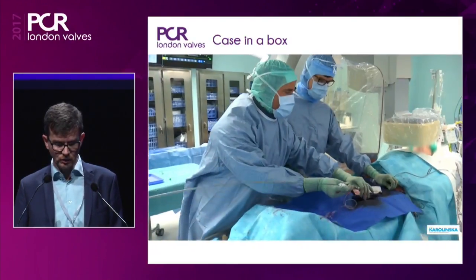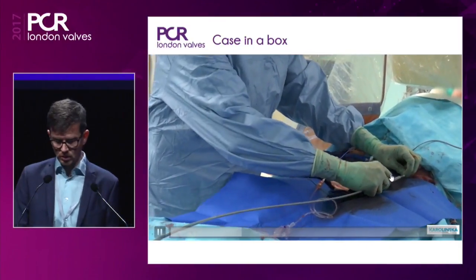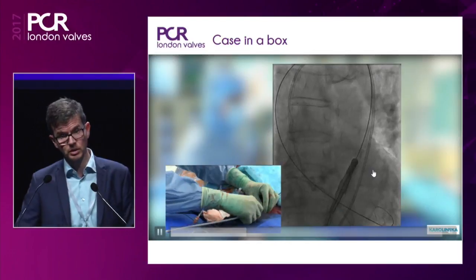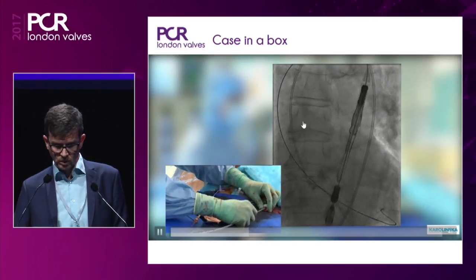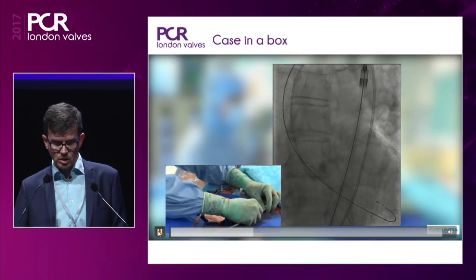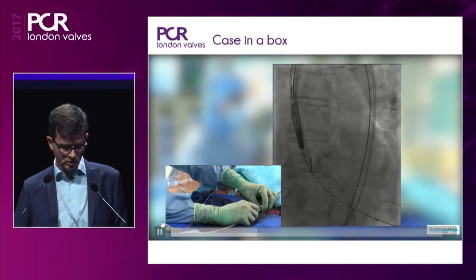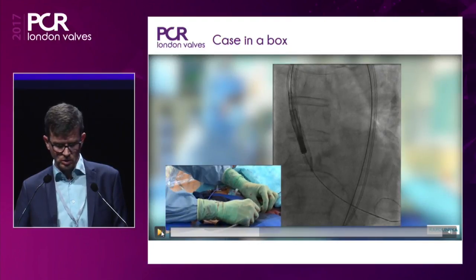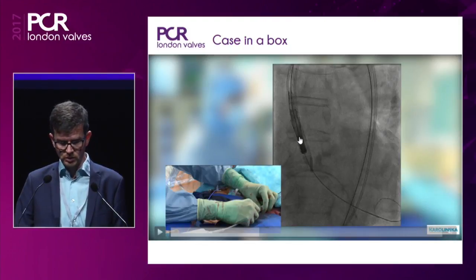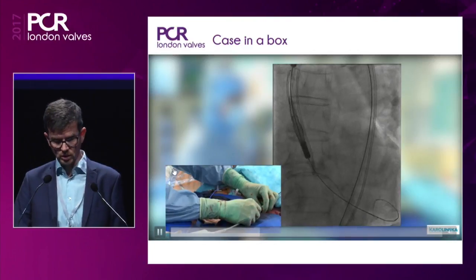Then comes the valve system. It comes with a small loader piece which makes entrance to the sheath easier — similar to the one seen on the Edwards S3 system. The valve is now coming up through the arch. It's very soft; it follows the outer curve very easily with almost no force required. The dark part is the stent holder, part of the delivery system. The valve stent starts from there and goes up.